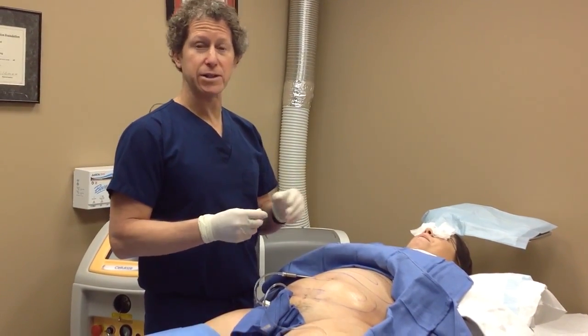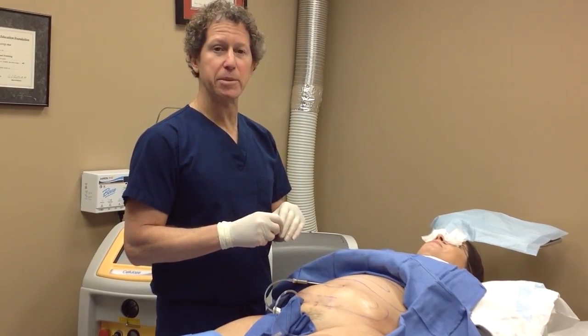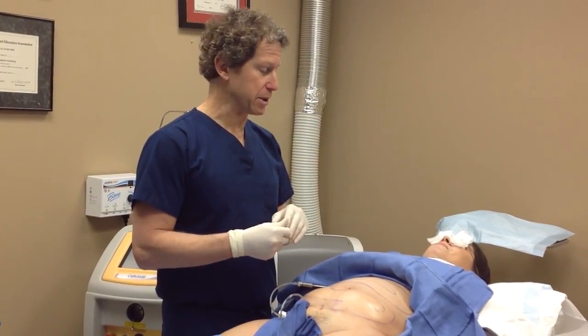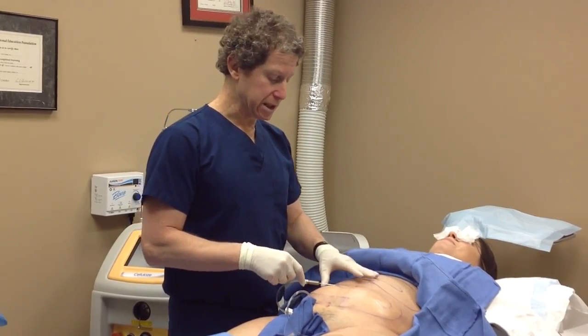Some patients are more anxious, and for those patients I give them some oral sedation — no IVs, just something to make them a little more calm and mellow. This lady is very relaxed, as about 80% of my patients choose not to have anything, and then they can drive themselves.